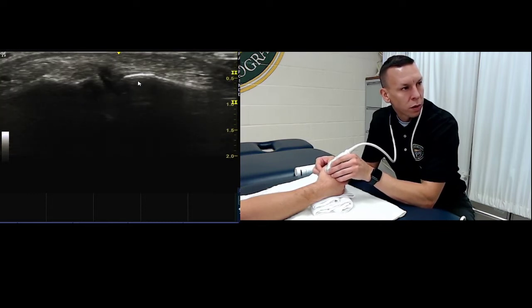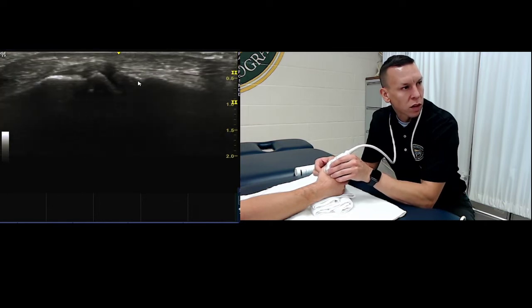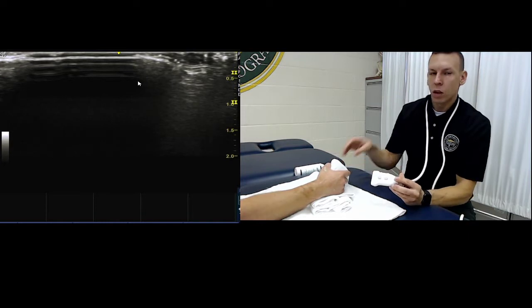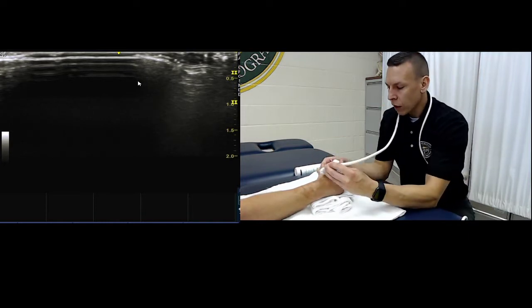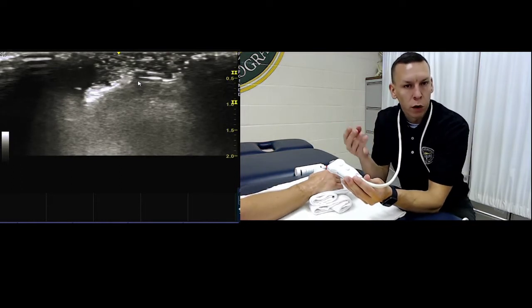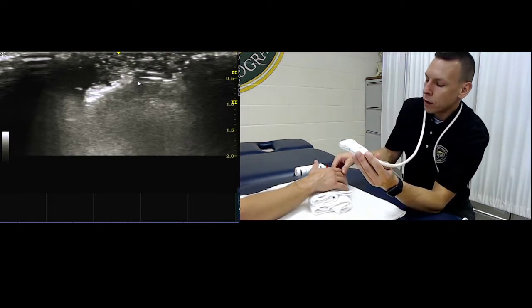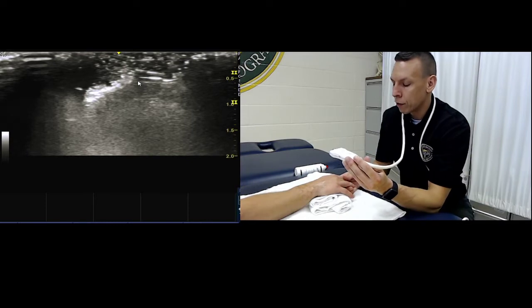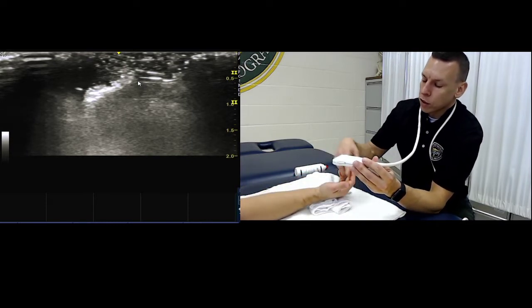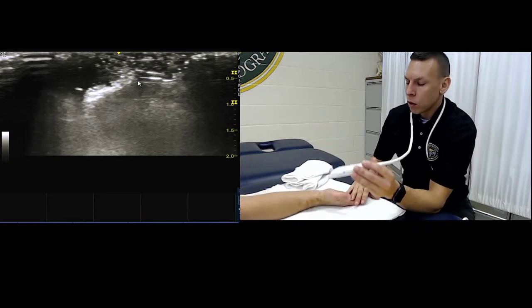And you feel like a pretty strict end point in there. You can see we're not seeing a very well defined ligament get taut, but that's okay. You're looking for other things in that same area. Is there fluid around there? Is there debris, anything like that after a potential tear? Now, after we've done that, we're going to flip the wrist over, okay?